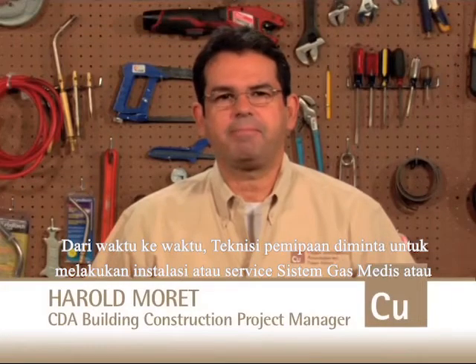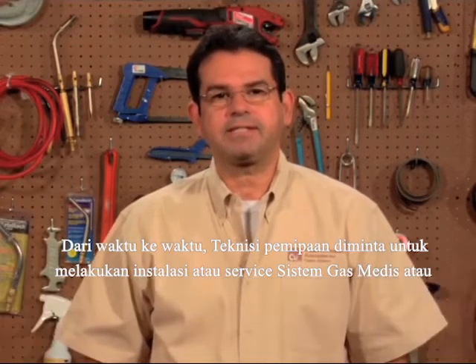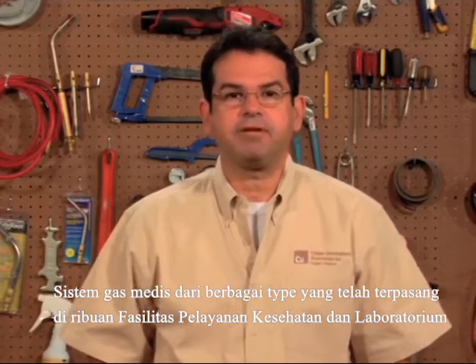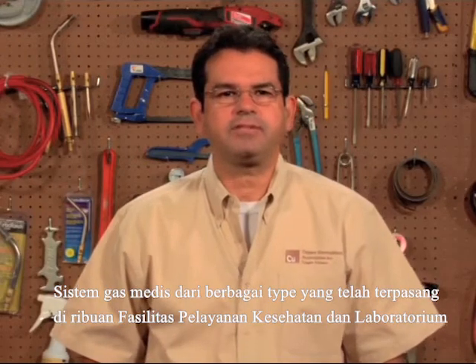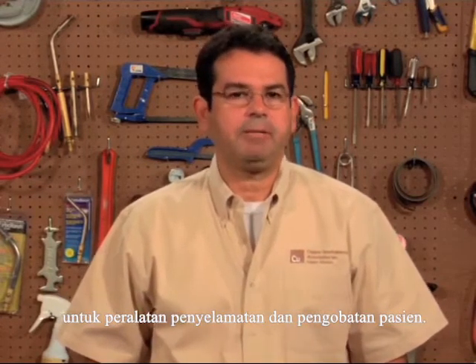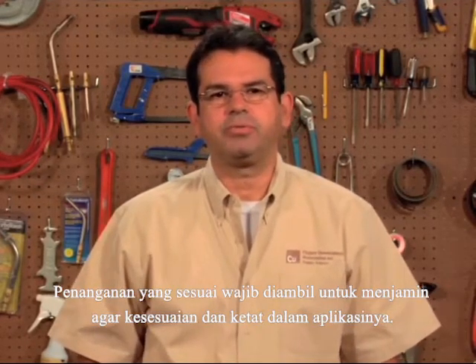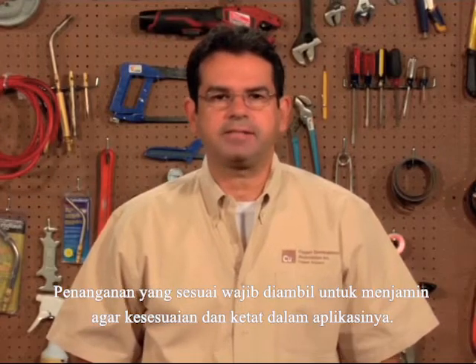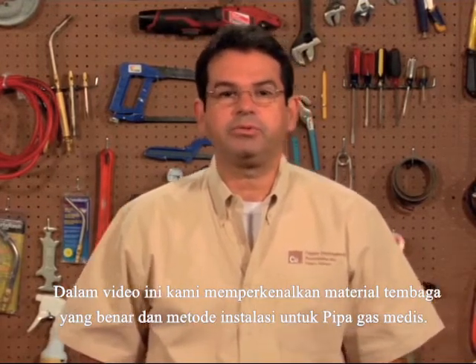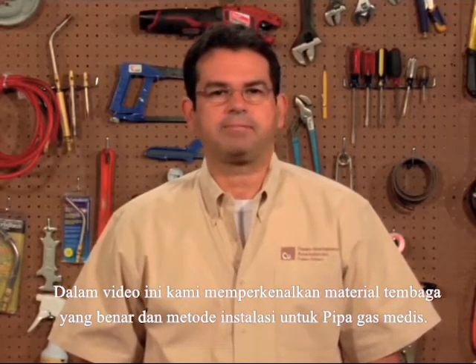From time to time, piping technicians may be called upon to install or service medical gas systems or distribution piping. Medical gas systems of various types are installed in thousands of healthcare and laboratory facilities for life-saving equipment and patient treatment. Proper care must be taken at all times to ensure that there is strict compliance with applicable codes. In this video, we will introduce you to approved copper materials and installation methods for medical gas piping.